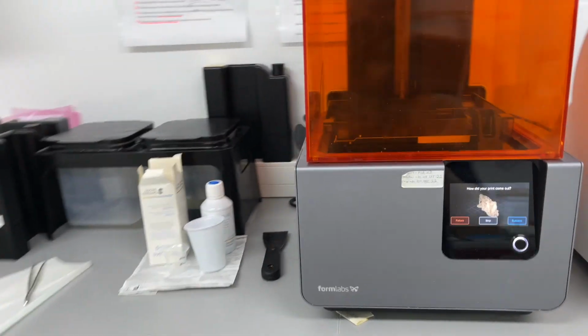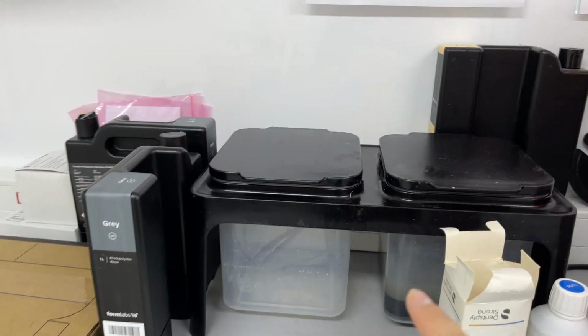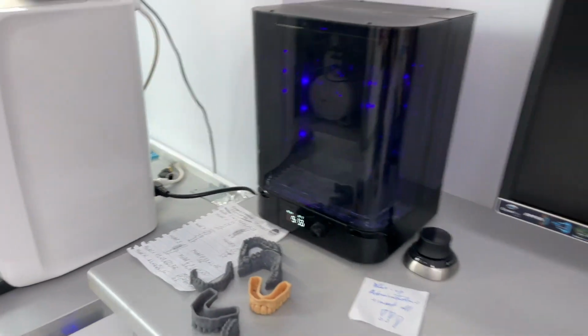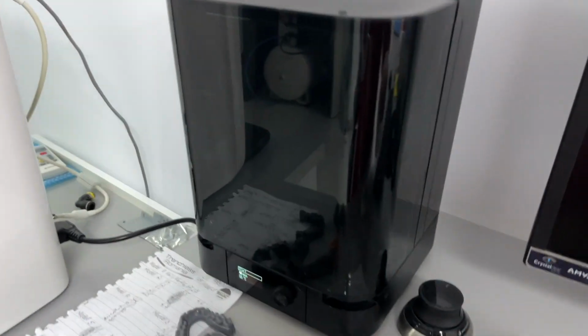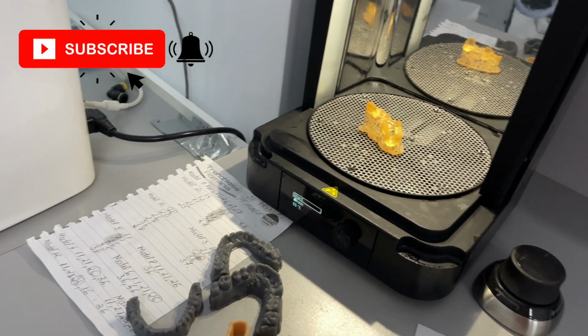Okay, so as I already showed you before, this is the 3D printer, and once this is done, we're gonna put it in here in the alcohol bath. Once this is done as well, we're gonna move to the machine that I just told you that we actually place it inside. It's a UV light machine that dries it, and it also strengthens it a bit. You can see it a little bit inside there. I will also show you when it's done, and that will be the final result of making a surgical guide. Okay, so now it's done, and we're just gonna have to open it and take it out.